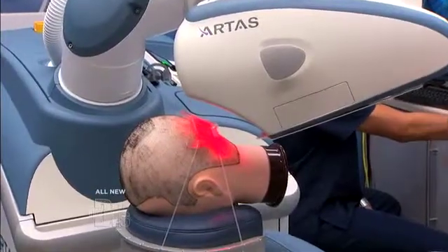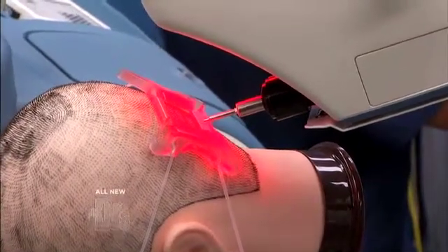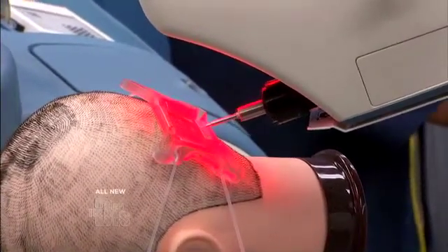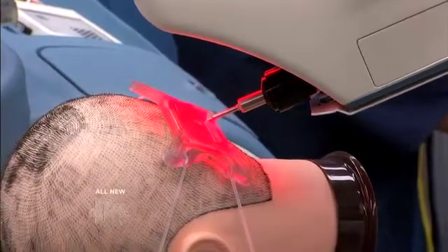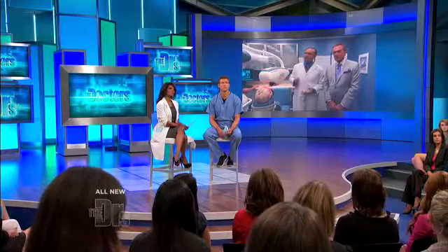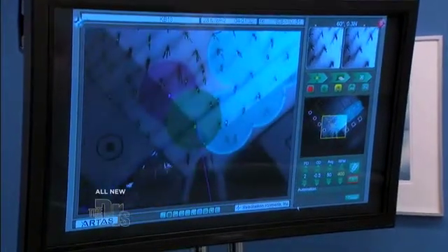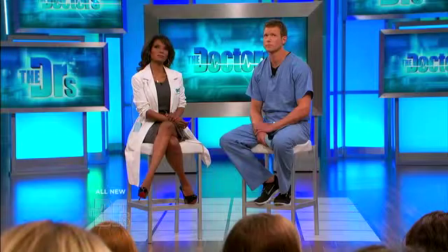Now it's already in position. I'm going to tell it to go ahead and start harvesting hair. This is an example of what the robot does in an actual surgery. We're not removing anything right now, but based on our direction, it's targeting certain follicles and taking out a certain percentage of hair follicles to leave some behind. It's random, so we're not going to get any weird patterns of extractions, and it's selecting these based on the quality of the hair. We can also tell it we want three hair grafts or two hair grafts.